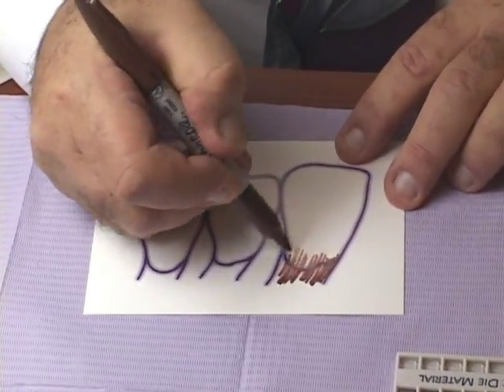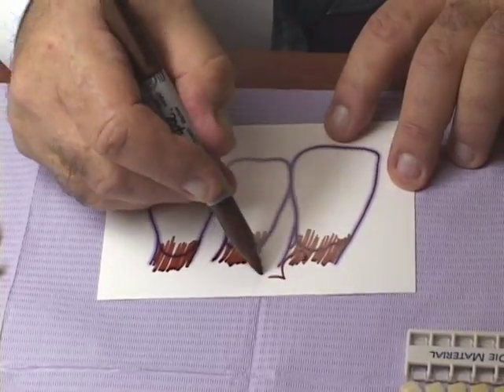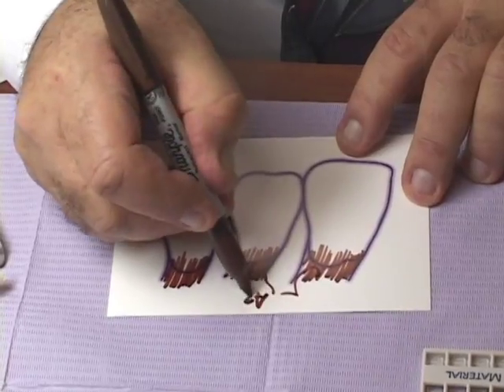So the first thing we need to do is take a look at the neck color of the tooth. In order to establish the neck or the root color of the tooth, you look at the CEJ area and find a shade guide that fits into that area and mark what part of the tooth it's covering. And now that's how we mark those areas. We have central, lateral, and cuspid. And we mark the area that is describing the dentin or the root color.